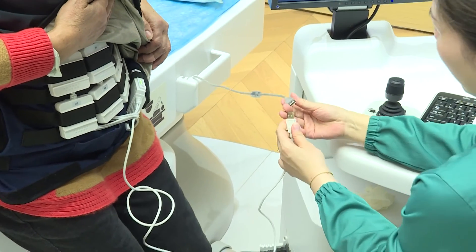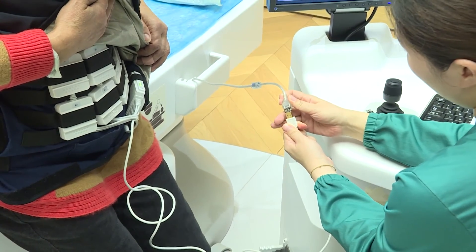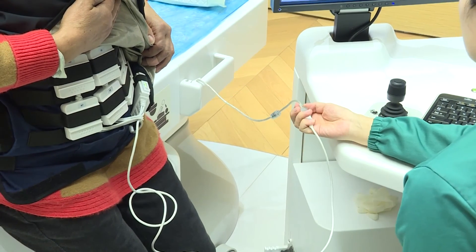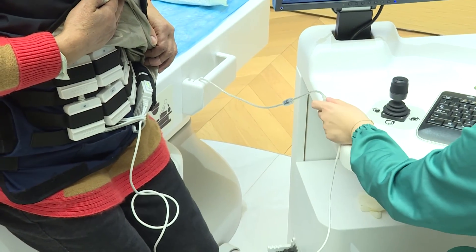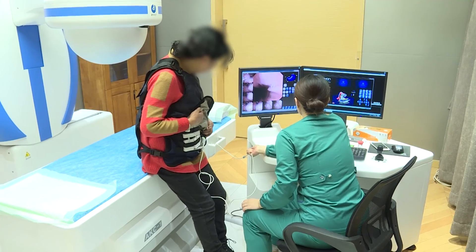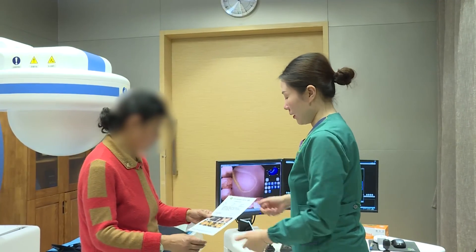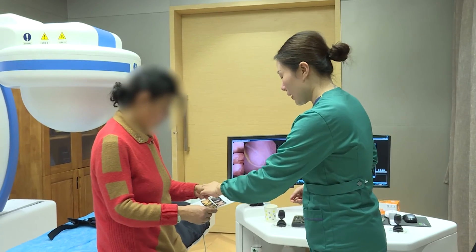The patient returned the data recorder the next day after the capsule battery expired. All images were downloaded to the computer workstation and reviewed by the reading physician, who would then generate an MCE report after carefully reviewing all captured images.